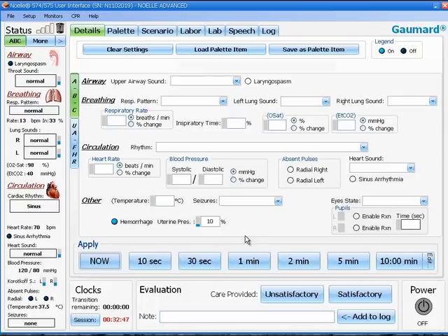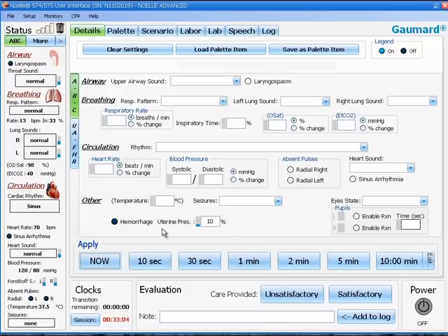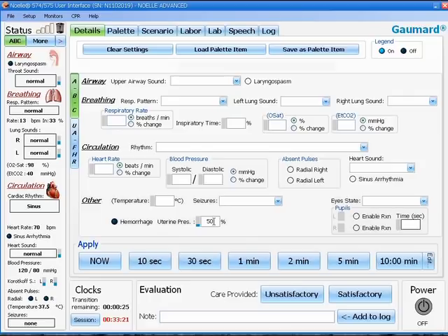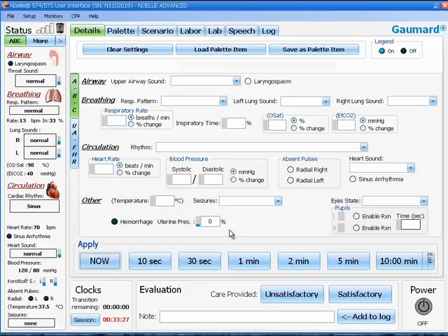After a fundal massage has occurred and the uterus has firmed up, you may turn off the bleeding by switching the hemorrhage boolean switch to dark blue. You can apply this immediately if you wish, or you can trend the uterine pressure up to a higher number to make it firmer, or you can release the air altogether so that you can palpate the built-in hard fundus of the 48-hour postpartum uterus.